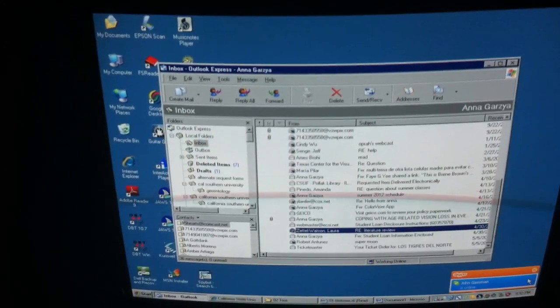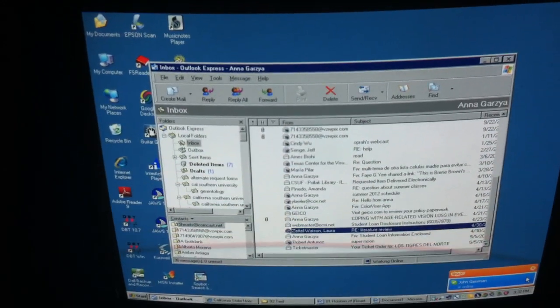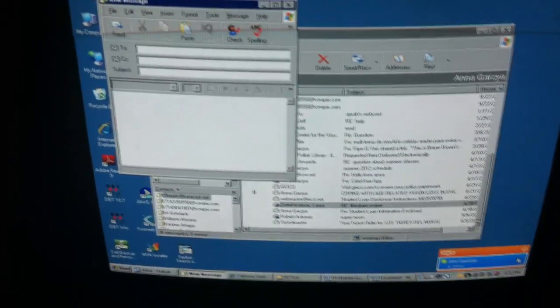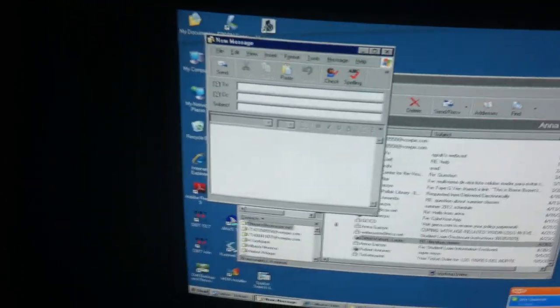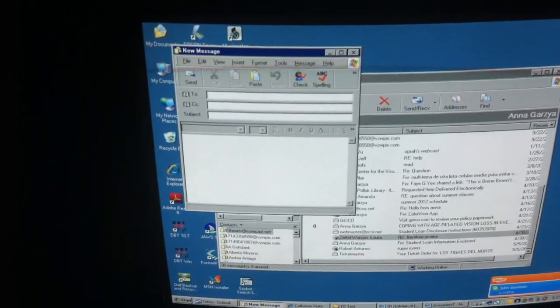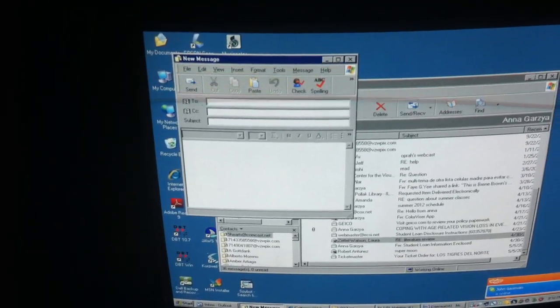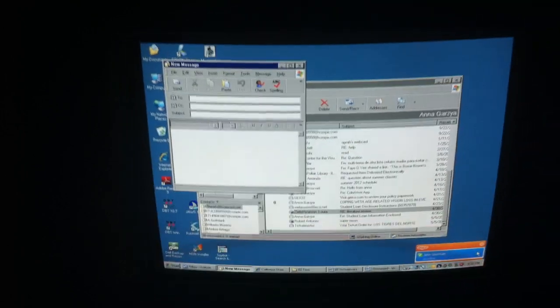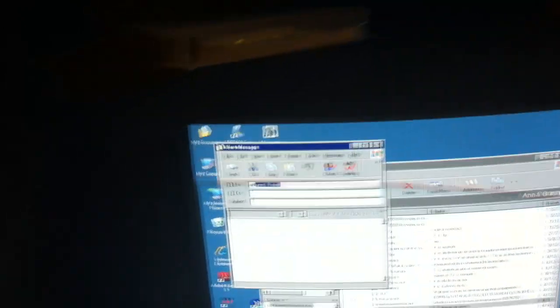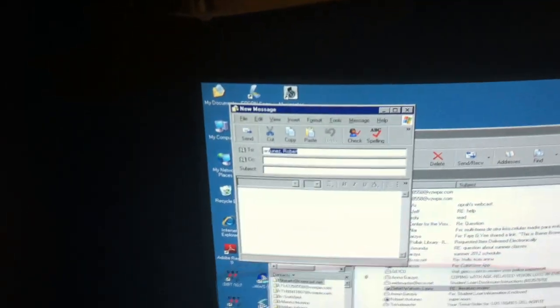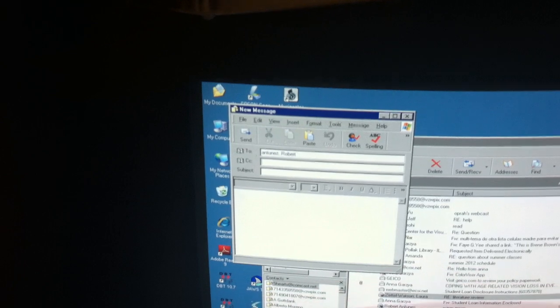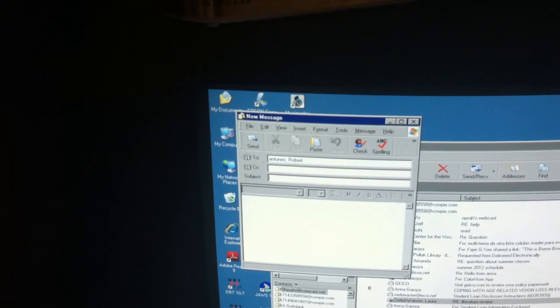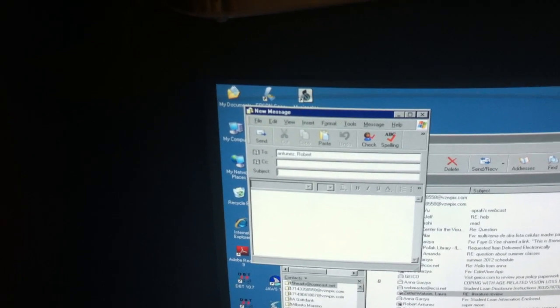So if I want to send an email, I'll do Control-N. Control-N, new message. I hear a new message. So I can just send it to, I don't know, one of my contacts. It says the name of the person. I tab. Subject. It says subject. I can just say hello.